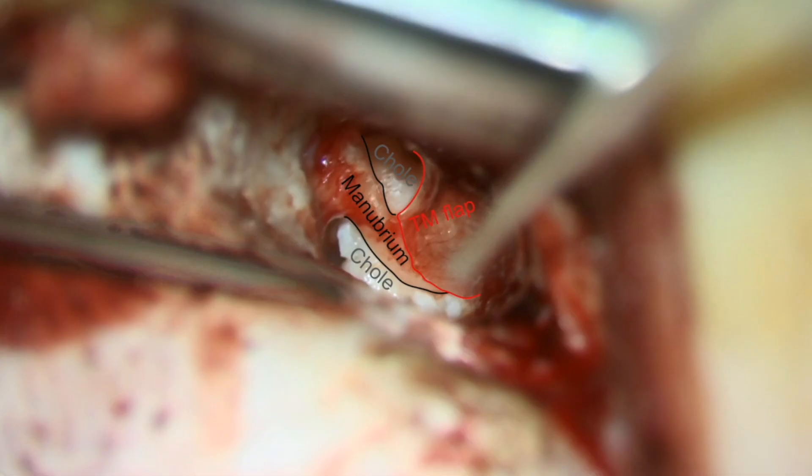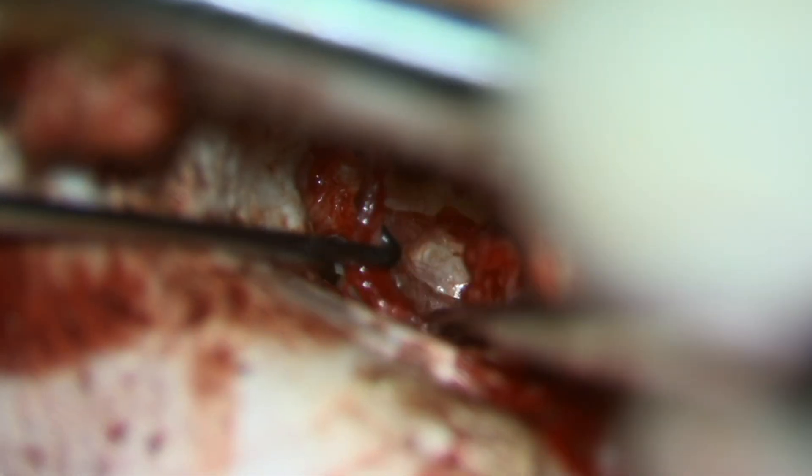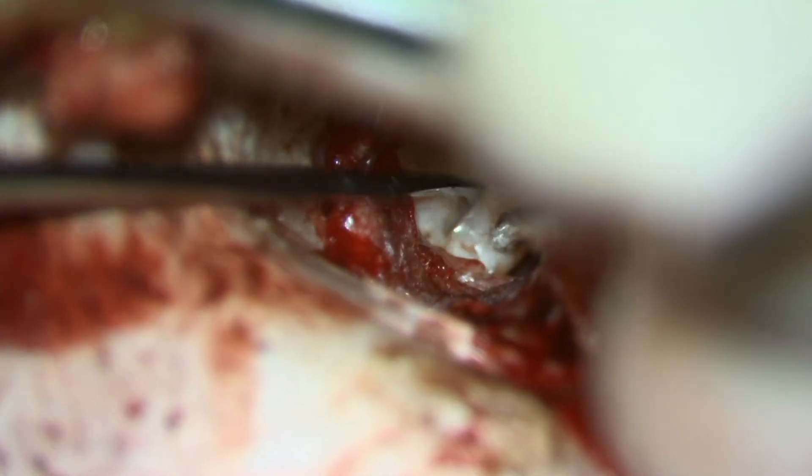Now you're looking in the ear canal from behind the ear from a posterior approach with the tympanomeatal flap raised. Now we can work from a combination of behind and in front of the eardrum, and the posterior approach allows us a more anterior view of this very anterior cholesteatoma.